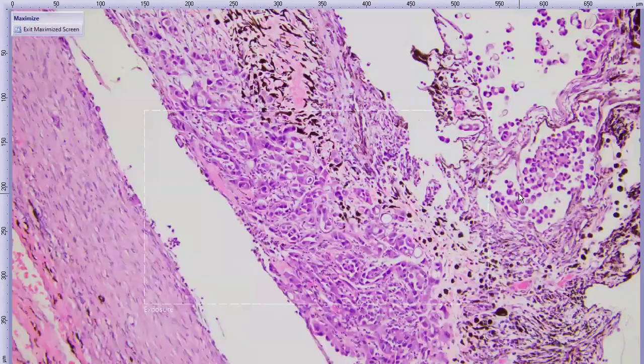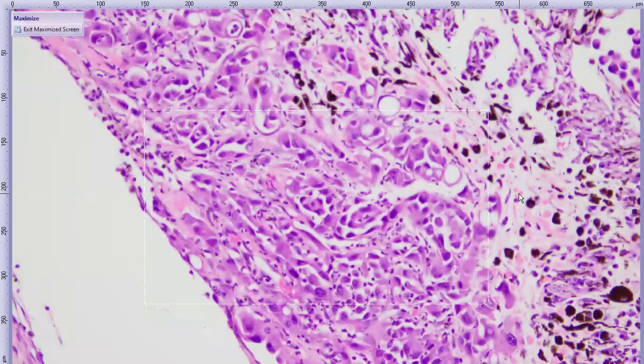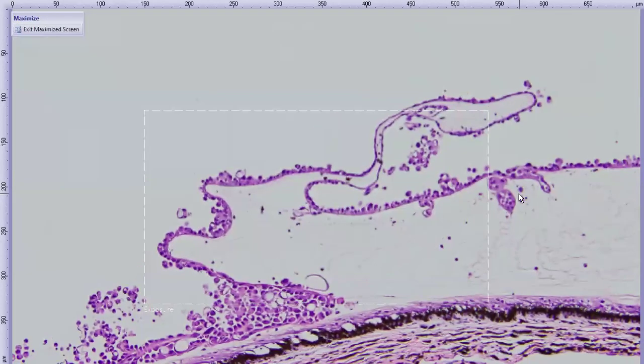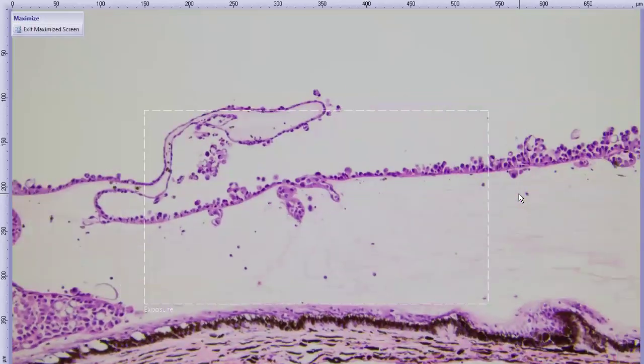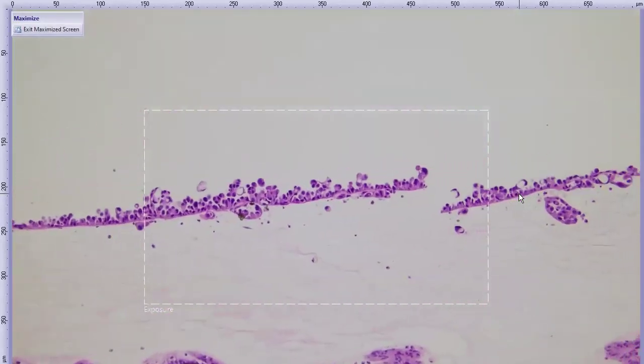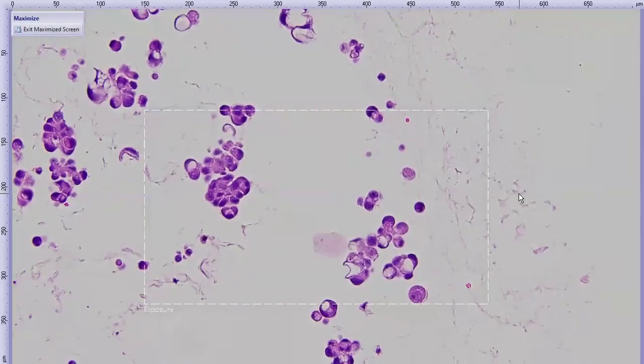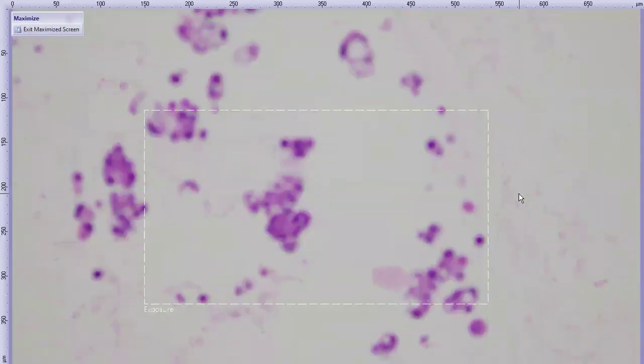And we can see them invading the uveal stroma multifocally. And when they do, they tend to form these little tiny lobules, maybe cords that anastomose. And if we track back here, we can see the same cells forming these strands freely floating off into the vitreous. And way back here, similar cells just free floating as little islands in the vitreal space.